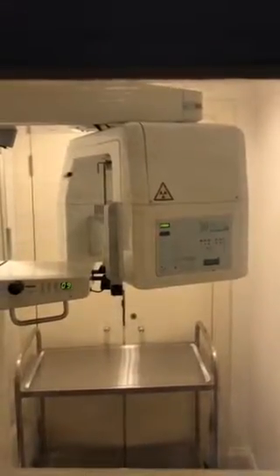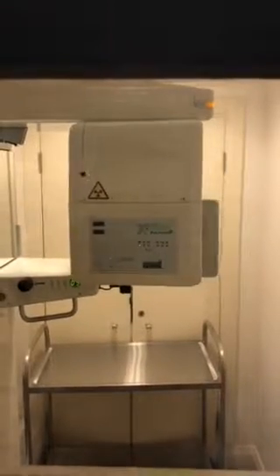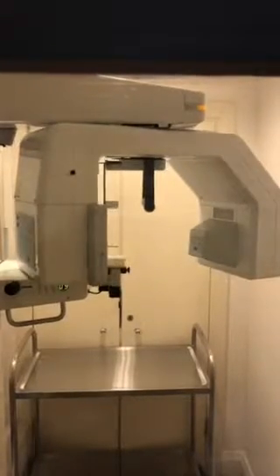and then ready to go. The x-ray machine will go round the face, and we would end up with an image. And as I say, that kind of x-ray is useful when examining wisdom teeth and checking the bone levels around the teeth, as well as for implant planning and things like that.